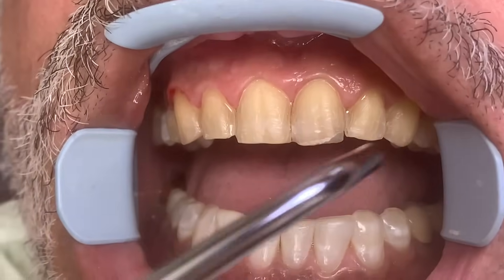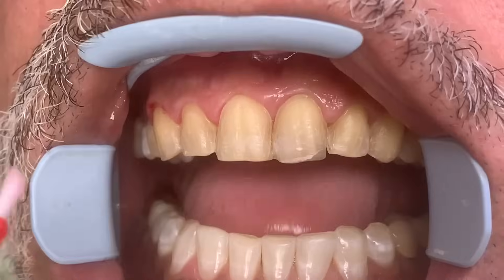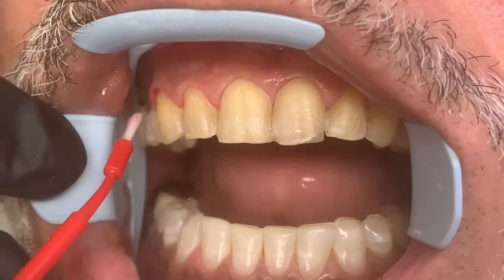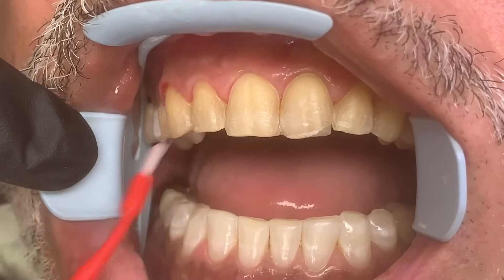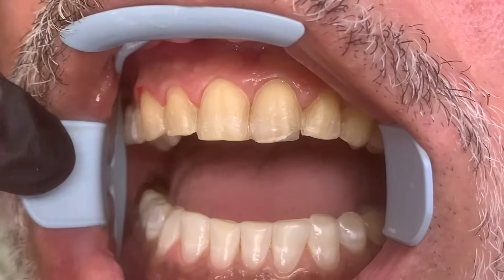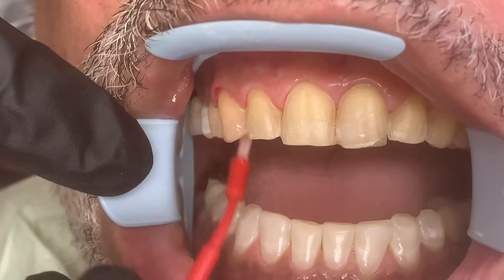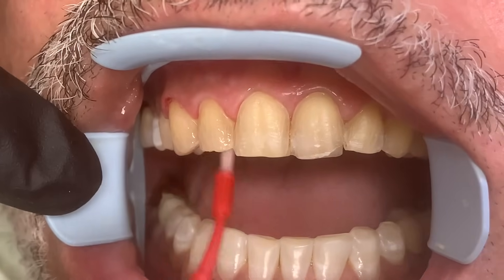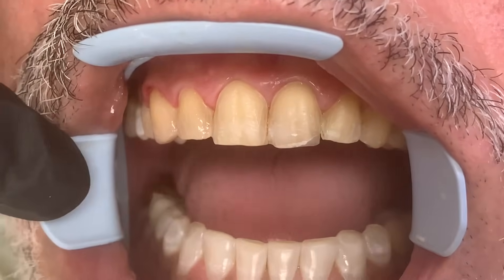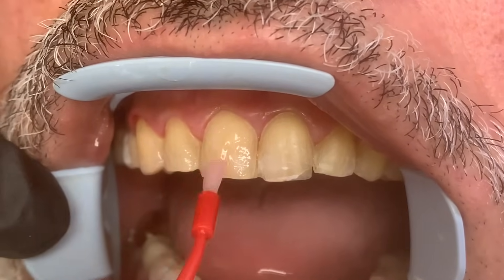First thing, we want to make sure everything's right — patient's good. We are placing an etchant, and this etchant is what's going to prepare the surface for the bonding agent, which prepares the surface for the cement that's actually going to hold these veneers in place.